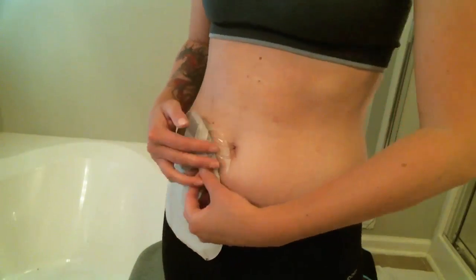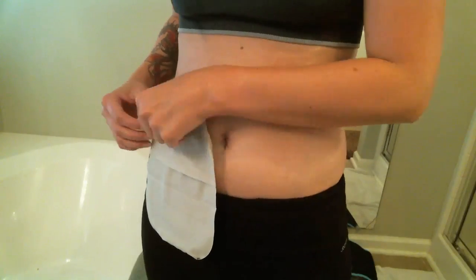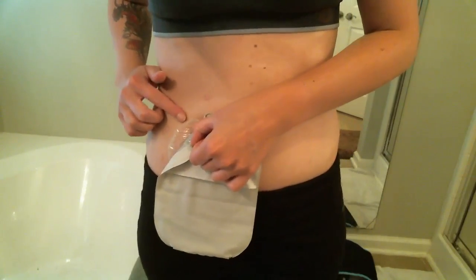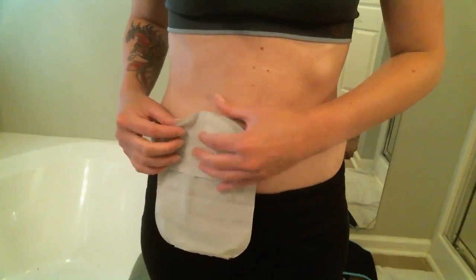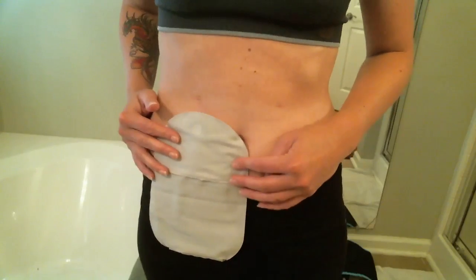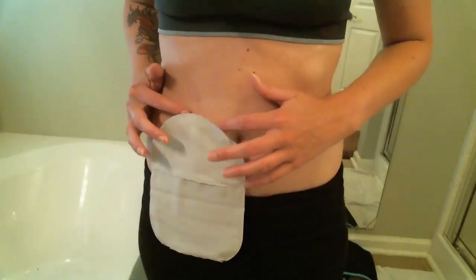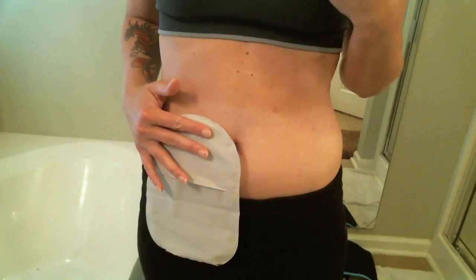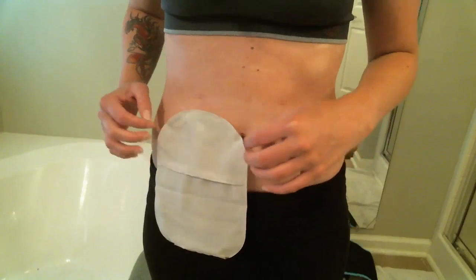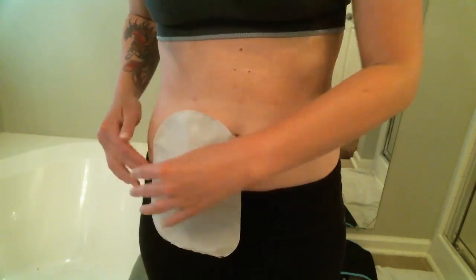You probably can't see, it's got a really thin plate here that sticks onto you. I am having a little pulling at the edges, but that may not be the bag's fault. I mentioned before that I have an issue with one pieces in the first place, so it could be something with that. And also I was dealing with a lot of skin irritation around here last night when I was putting this on. So it's very likely that I did not do as good of a job putting the bag on.